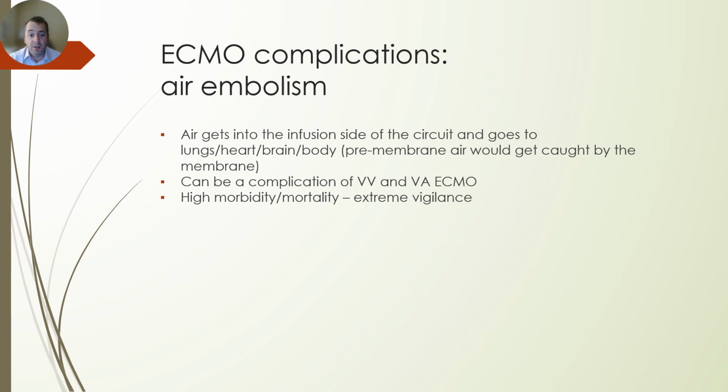Air embolism can potentially be a complication of both VV and VA ECMO, especially if there's a PFO or other shunt, and it has very high morbidity and mortality, so requires extreme vigilance to make sure all the connectors and caps are on properly. This doesn't happen.